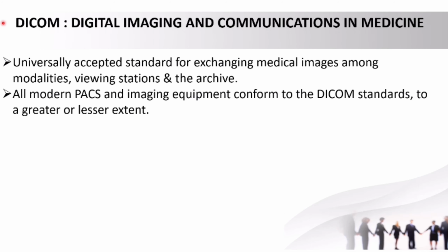Now we have DICOM. It is the standard way of exchanging the images. It stands for Digital Imaging and Communication in Medicine. It is a universally accepted standard for exchanging medical images among modalities, viewing stations and the archive. All modern PACS and imaging equipment conform to the DICOM standard to a greater or lesser extent. So whenever we need images or we have to export images, we always take them in the DICOM format.